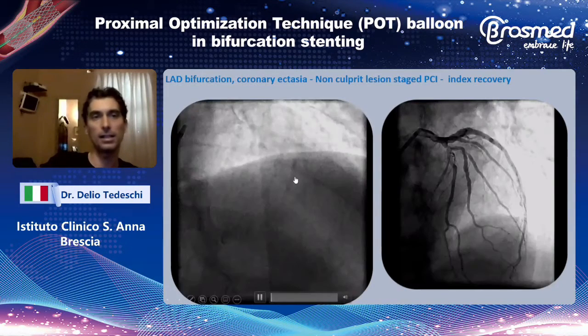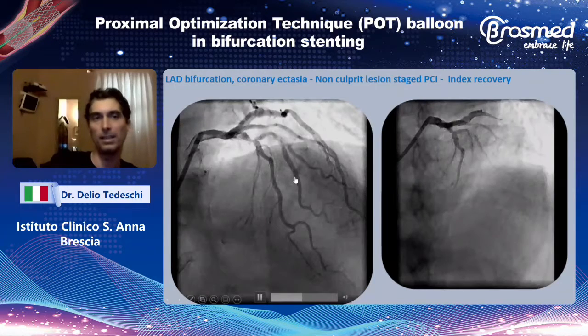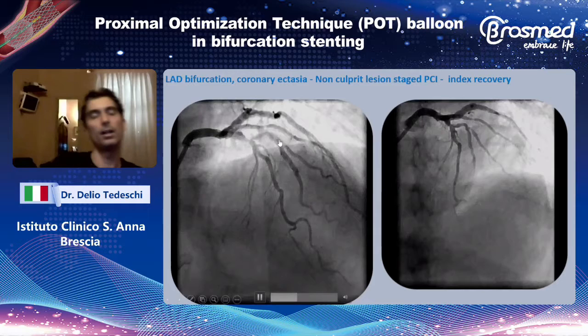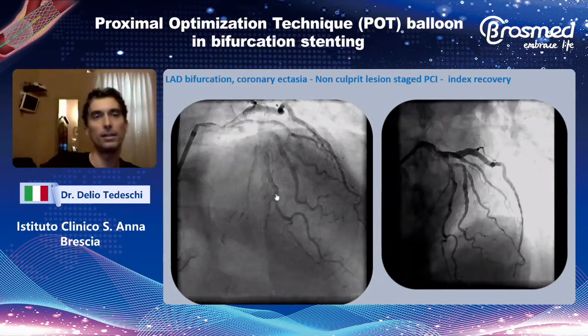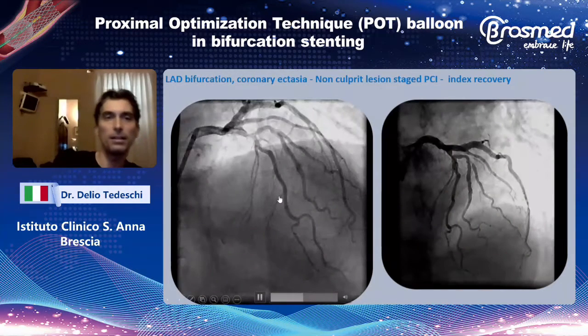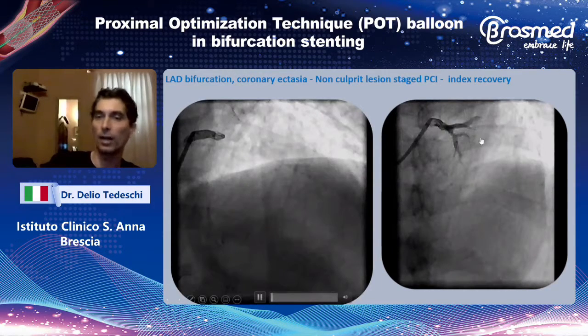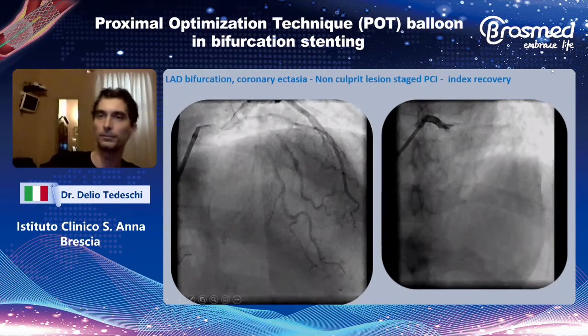Of course, this is a Medina 100 bifurcation, but I had some doubt about the possibility of some disease at the level of the ostium of the diagonal.